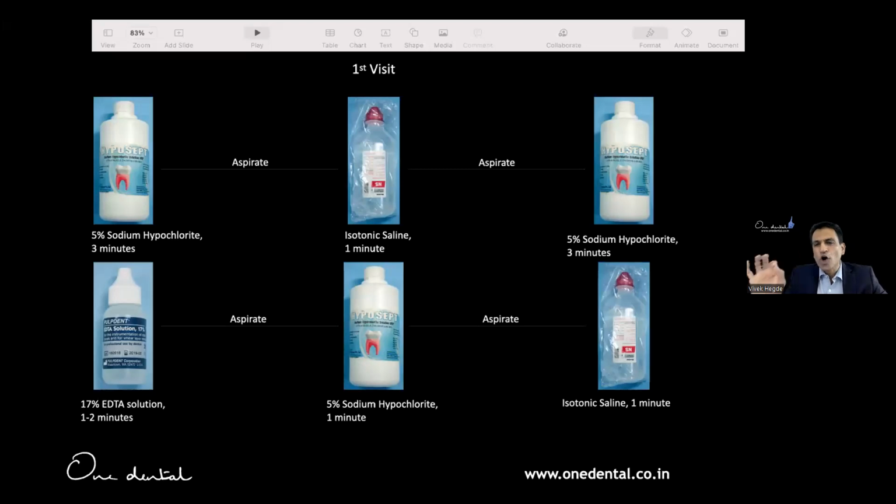Because hypochlorite is a salt. The salt can cause brittleness of the dentinal tubules and can cause micro cracks or fractures in the long run. We don't want all that. I want to be very simple and practical. So this is the protocol I want all of you to follow after your master shape is done.